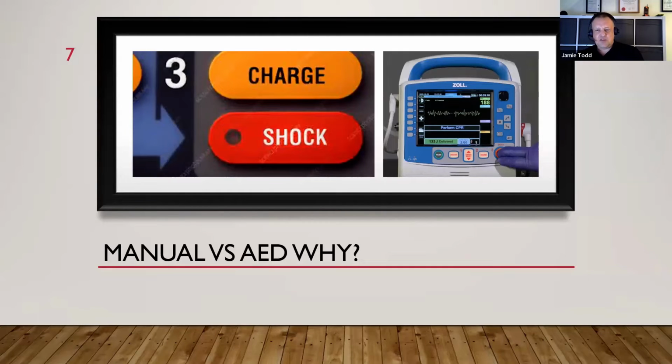And while those automated machines were being used by, as a whole, non-clinicians in the early days of AEDs in the community, then clearly that's acceptable, because the delivery of early defibrillation is one of the very few things proven in resuscitation science. So if it needed the machine to be relatively slow to do that reliably, then delivering that defibrillation is always going to be faster than the arrival of someone else with a defibrillator, possibly from the ambulance service.